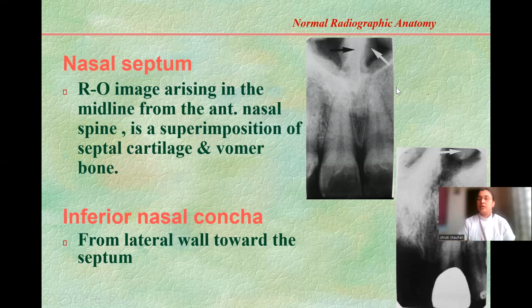When we're taking an X-ray of your maxillary central incisor, what is the angulation that we're giving? We're giving a plus 40. So we're going to take our X-ray cone. I'll just put my head like this for a second so that you understand. Obviously, I'll get my glasses removed before I take the X-ray. I'll take my cone, PID, position it here, make the person look down, place a film, and I will shoot at plus 40.